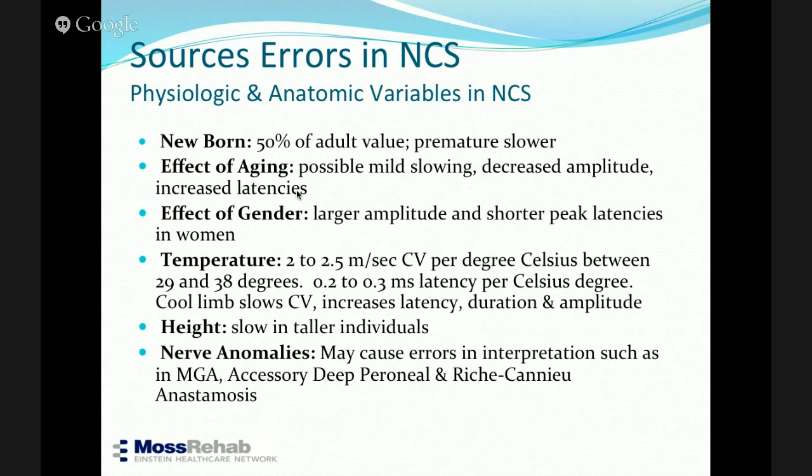What is the reason why there is increasing latency, duration, and amplitude with cool temperature? Why should temperature affect the duration and amplitude? Anybody? Is there like a lower threshold to depolarize the muscle cells, and so you're getting more fibers? It has to do with a physiologic factor. How about you guys, who are in the lab right now?